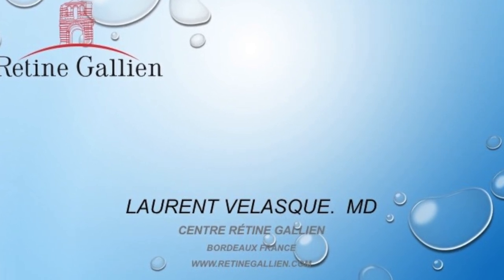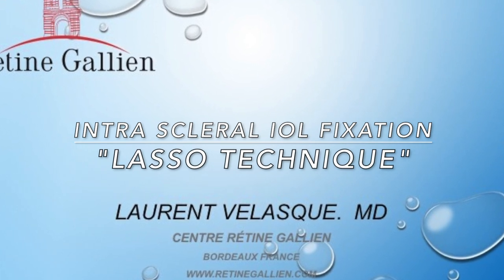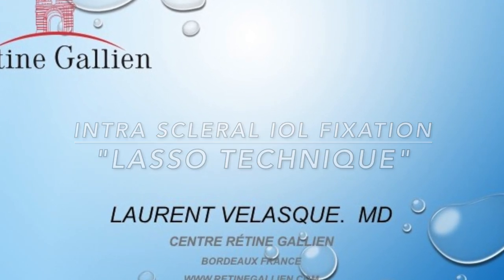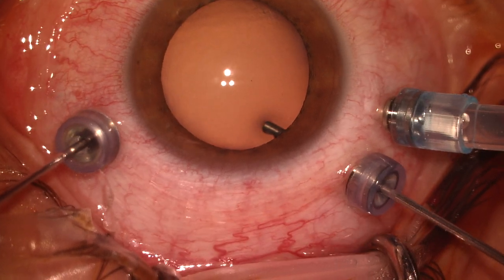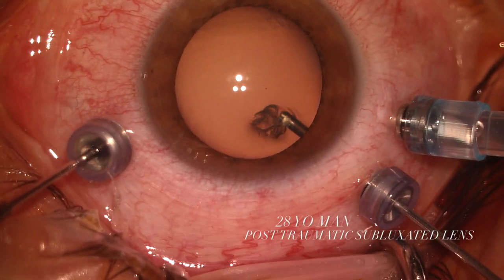Intrascleral fixation of intraocular lens is often difficult due to the complexity of the haptic prehension. Here is a technique called the lasso technique, using a disposable device called the Flexi-Loop.